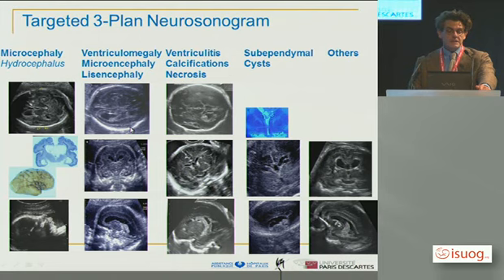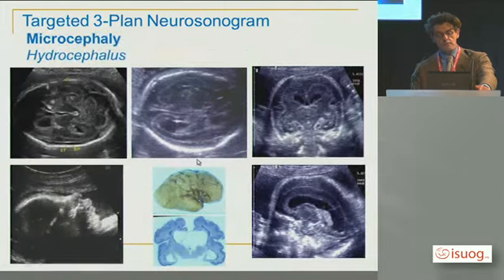So this is of such severe and typical aspect that, if you're looking for it, you're unlikely to miss it. Above the biometry of the head is the view of the fetal profile with a sloping forehead, more evocative of microcephaly. The features can be more subtle.